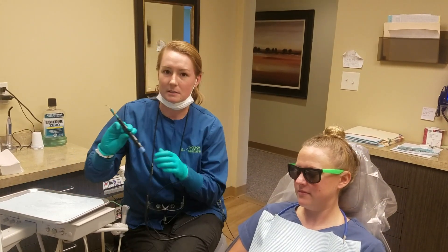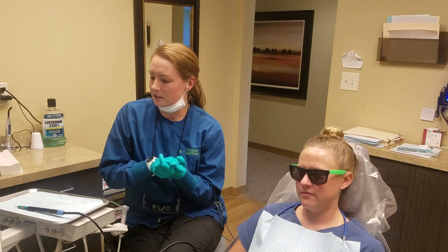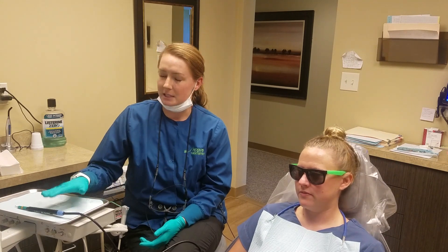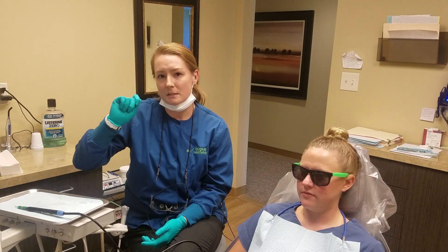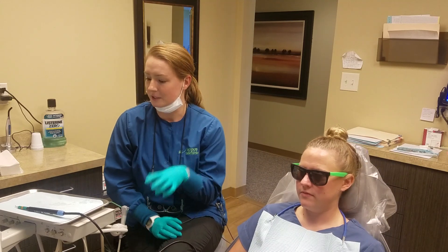We're just gonna talk about this ultrasonic scaler, or a Cavitron. I like to use this a lot — personally I use it for as many patients as I can. I use this instead of using the hand instruments, the ones that are scraping right along the teeth. So I use this and the hand instruments to do a full cleaning.